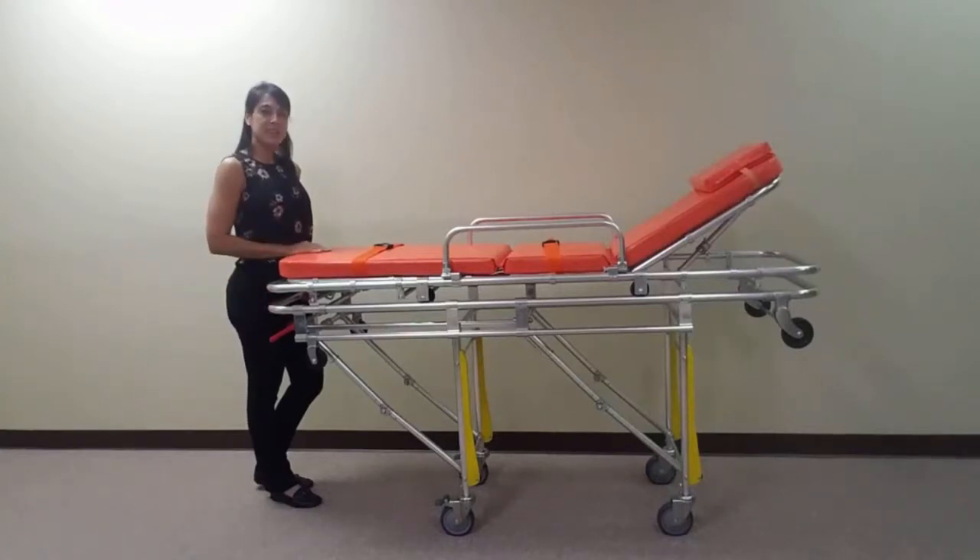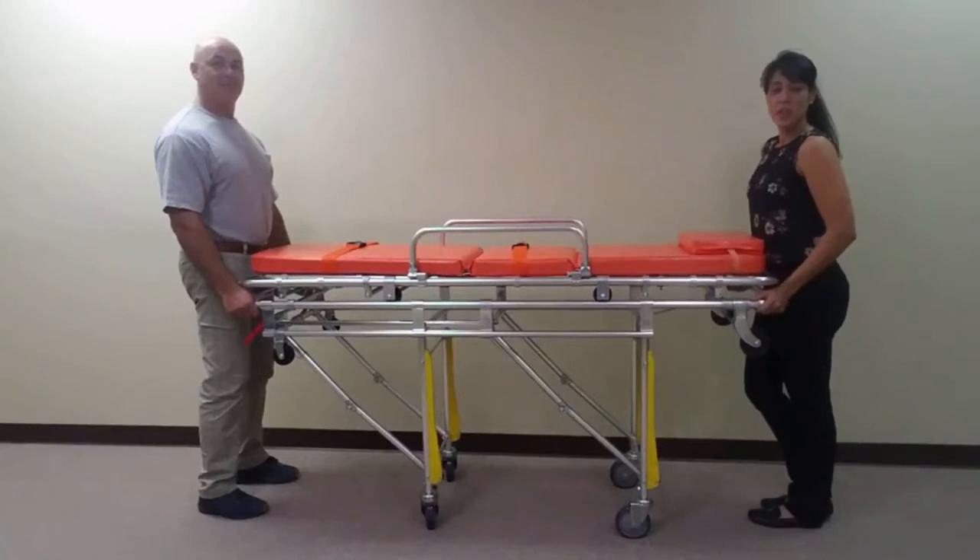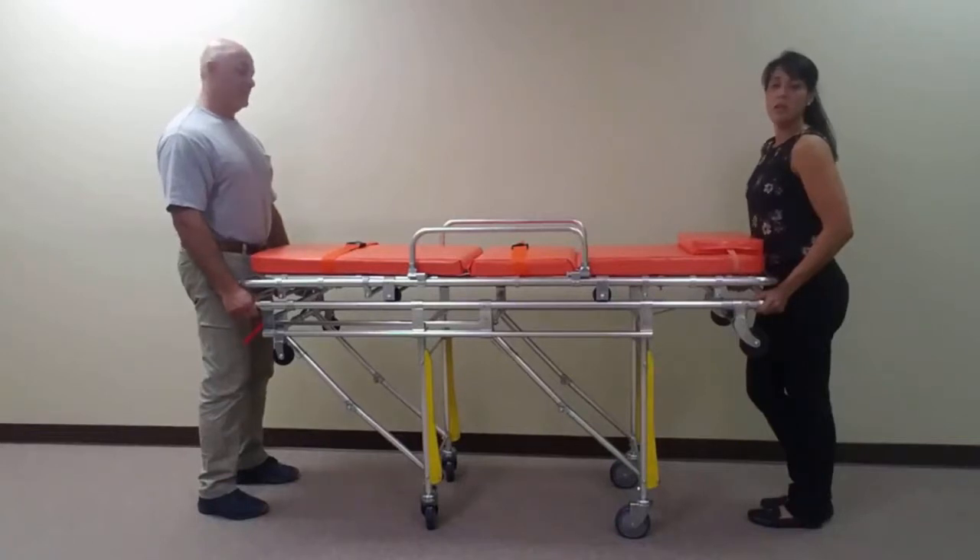These next clips will demonstrate lowering and raising the stretcher. To lower the stretcher, simultaneously squeeze both red levers located at the foot end of the stretcher and lower the stretcher slowly. To raise the stretcher, simply lift the stretcher back up until the legs spring back into place.